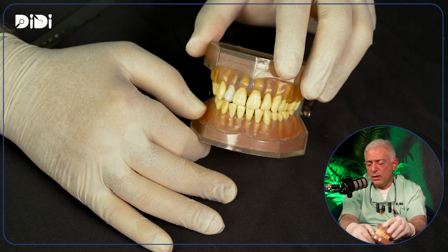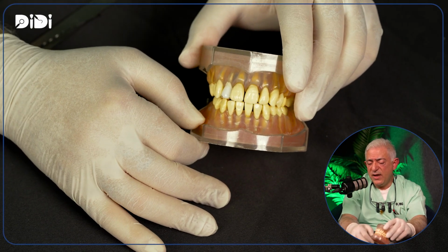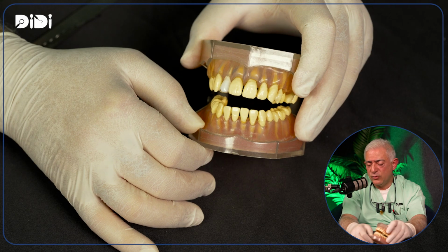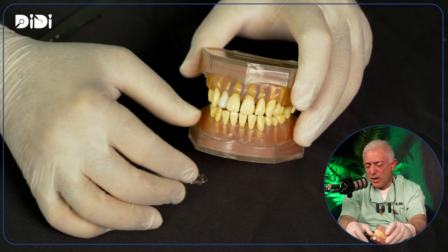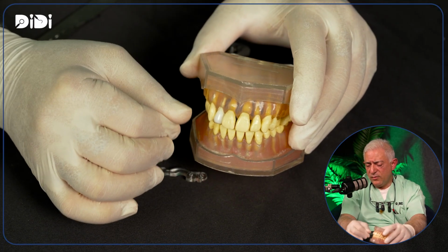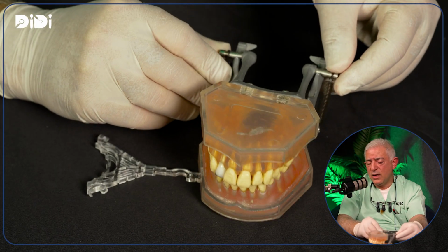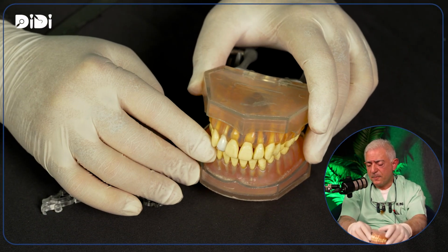Now, this will make me not use a facebow. So the lab doesn't have to worry about a facebow. I don't have to worry about a facebow because I took this inside the mouth, not with an open vertical. And because I know it's only 1.5, up to 5 millimeter, there will be no pressure on the condyles in the literature. So 1.5 is safe.